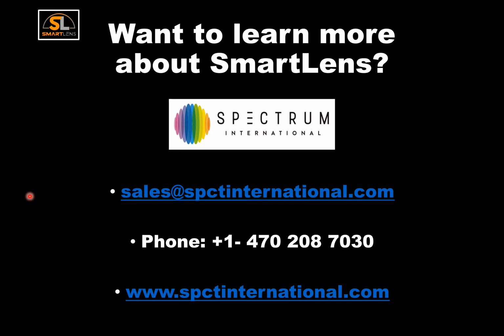So you can compensate with any of the zones of the lens, or you can just tell Spectrum International that I've fit the 4200 sag lens. I want to increase the edge lift 3 steps, but I want to keep the depth the same. If you tell Spectrum that adjustment, their consultants can automatically make that change. Dr. Nasser, thank you so much.